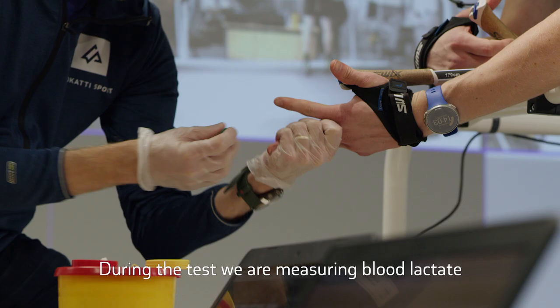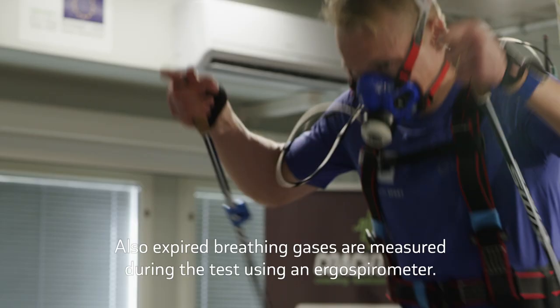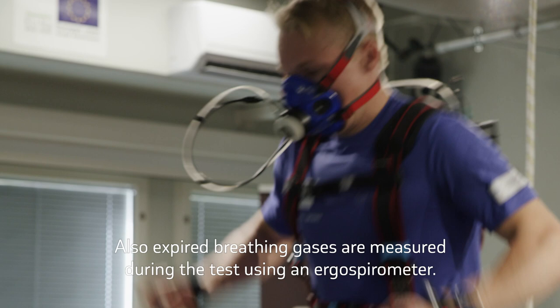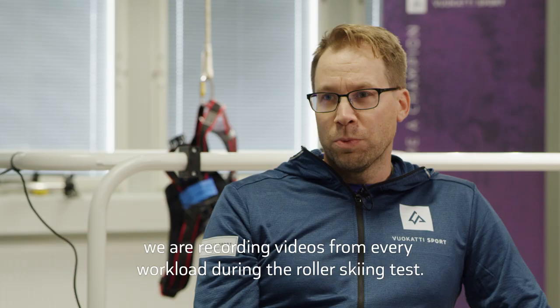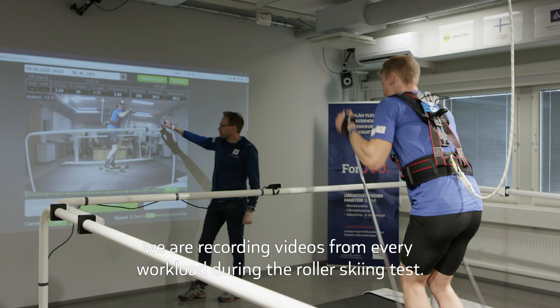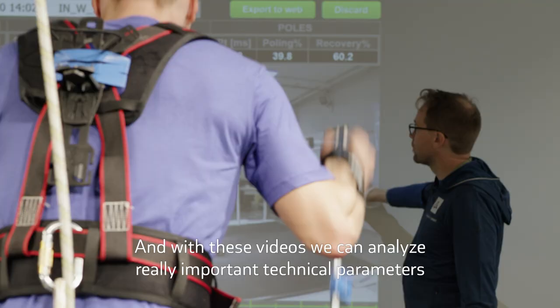During the test we are measuring blood lactate from the fingertip between every load after 3 minutes. Also, expired breathing gases are measured during the test using an ergospirometer. In addition to these physiological parameters, we are recording videos from every workload during the roller skiing test.